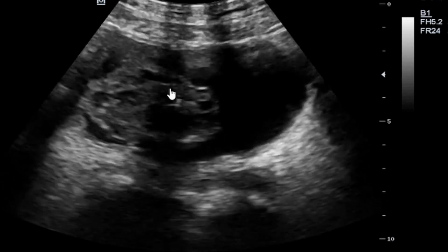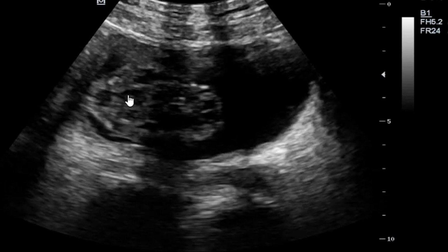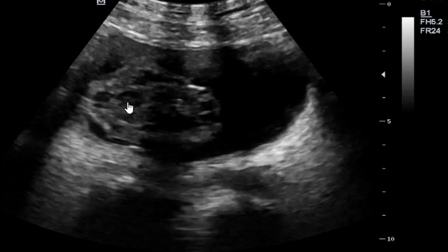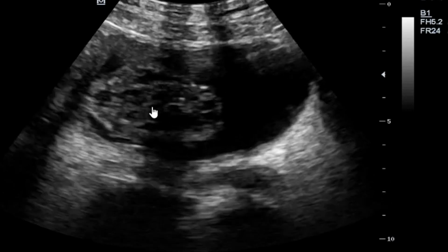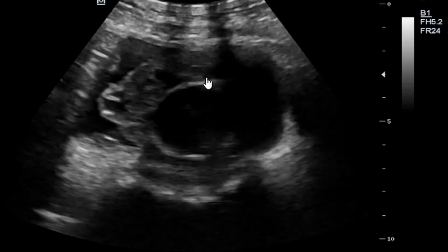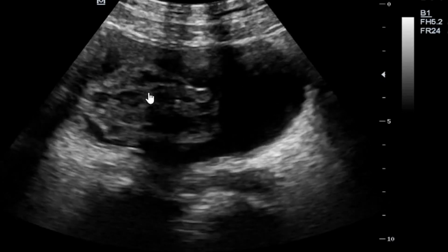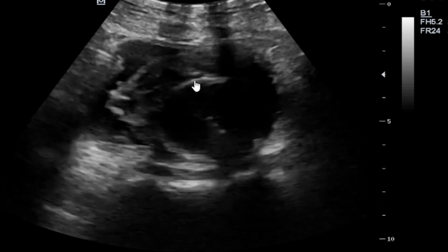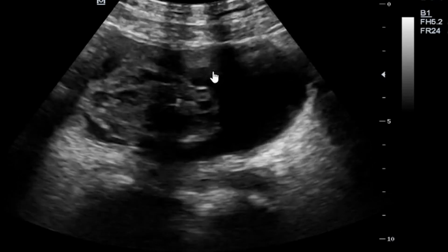So this is what we essentially call an organizing hematoma. We are saying that blood is clumping or clotting around our catheter bulb, as you can appreciate from this end. This is what we call an organizing hematoma, where the clot is forming around the catheter bulb.